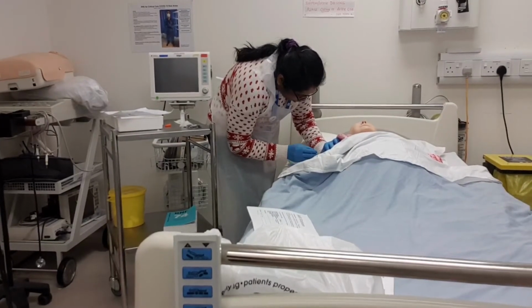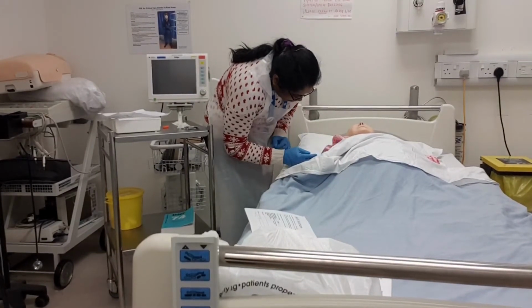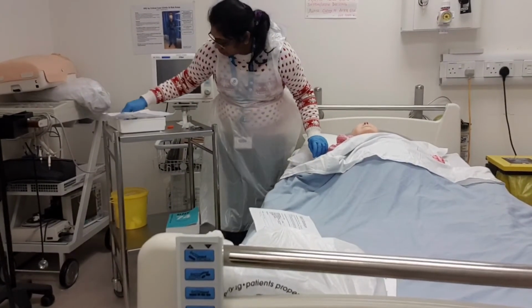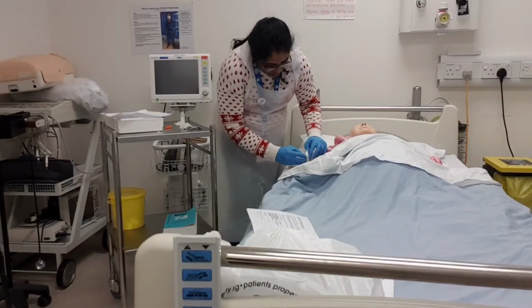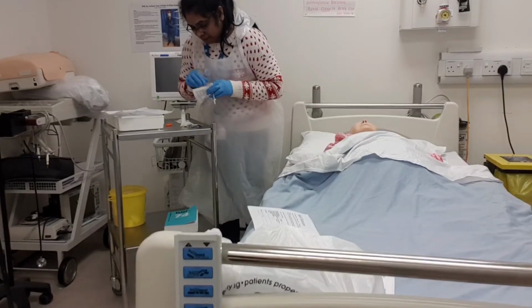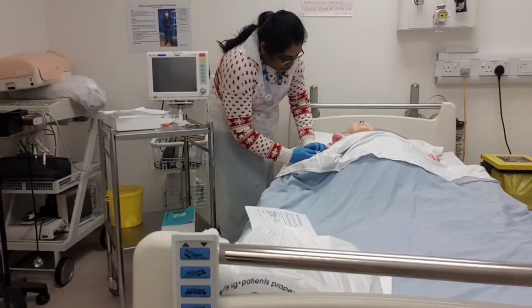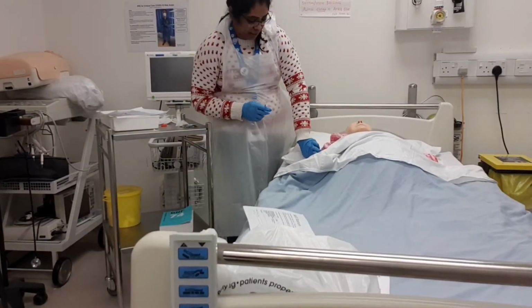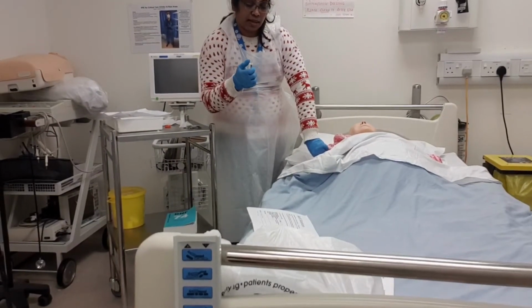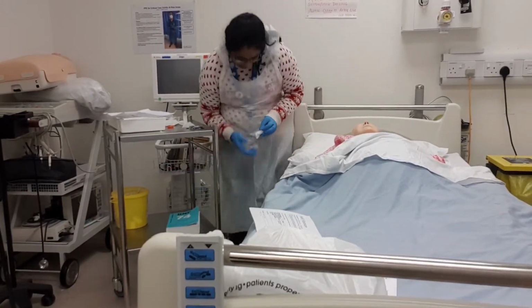1, 2, 3, 4, 5, 6, 7, 8, 9. Okay? Now, are you okay? Good. There's no bleeding. Still, I will just keep gauze there. I don't massage the area, just press it. There's no bleeding. So, are you comfortable? Okay, I'm just activating my safety device. And I will discard into my sharps box.